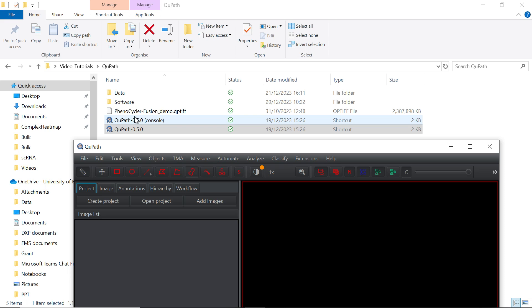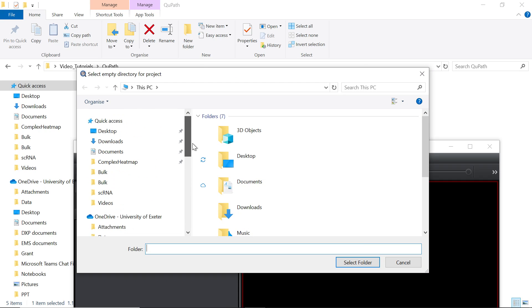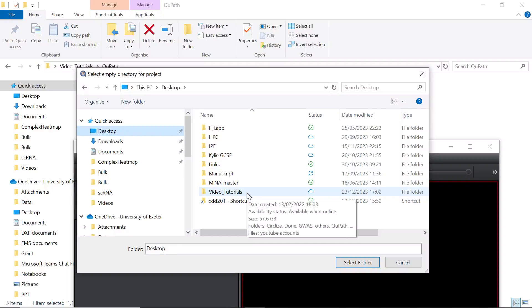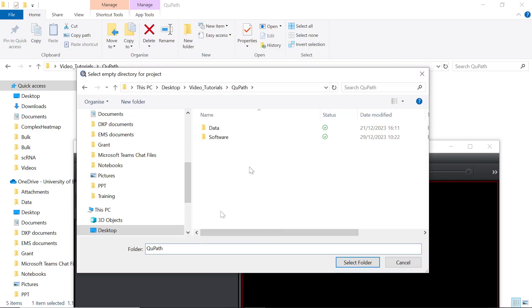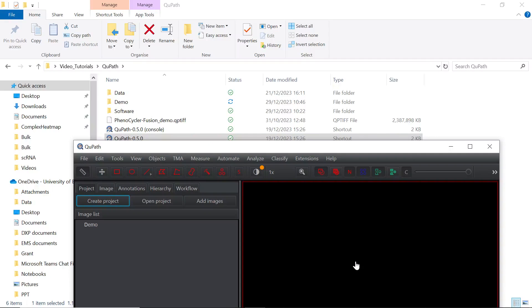To perform the analysis, first we need to create a project. You can click the create project button. It asks you where you want to save your project. We can create a folder in my QPath folder, create a new folder and name it as demo. Now we select this demo folder and save our project there.